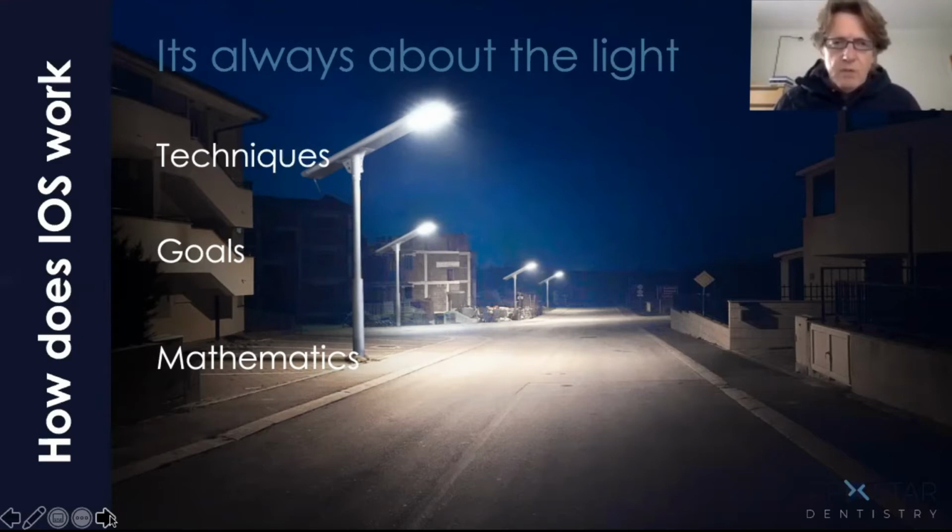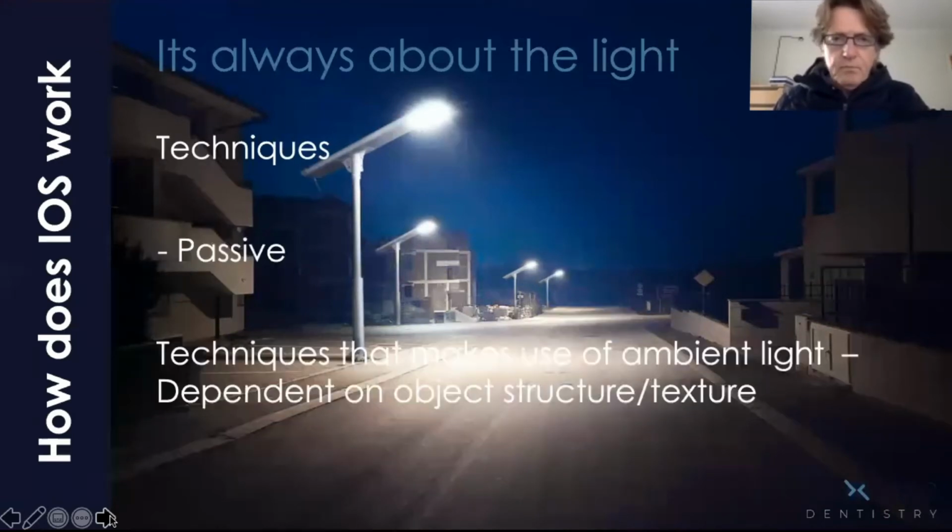So we're going to look a little bit at the techniques that we use with intraoral scanners. We're going to look at the goal of the scanner. And then I'm going to do a little bit of mathematics. Now, mathematics for me is a serious challenge to my IQ, so I'm only going to touch on how 3D reconstruction really works.